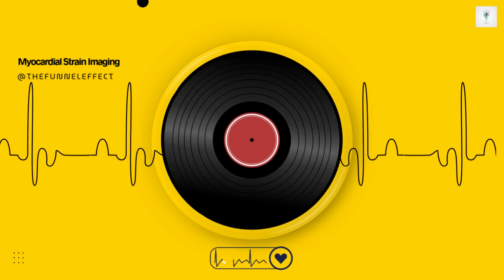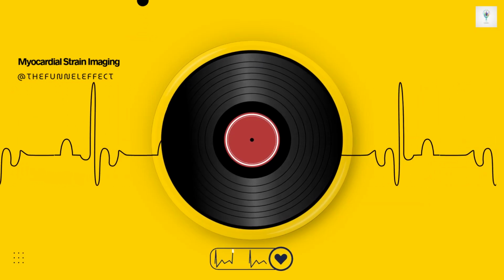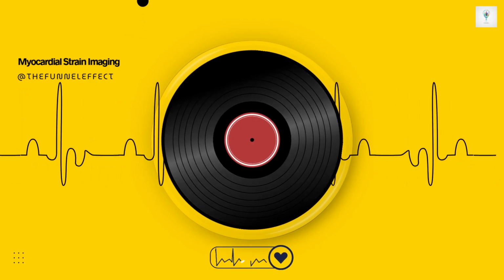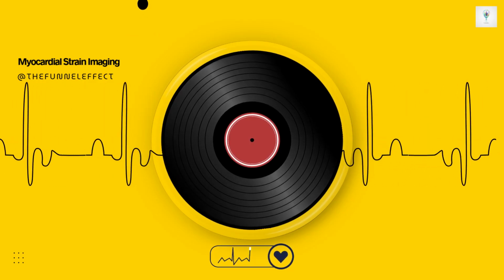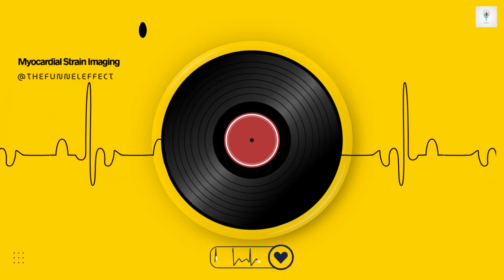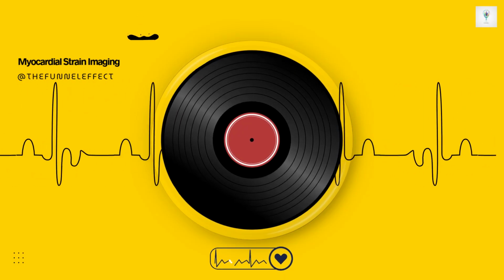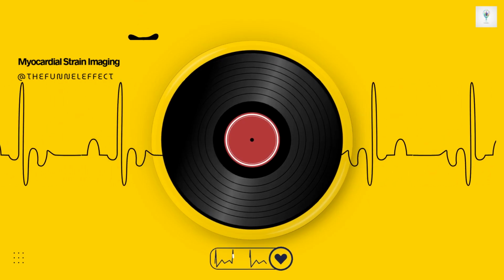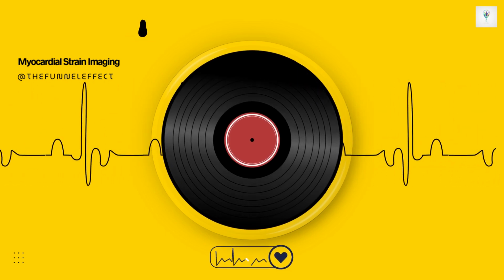And what does that mean for clinical use, if it's more variable? This is really critical. Because of that higher variability, especially when you're trying to track subtle motion differences between small regions of the heart, segmental strain measurements using CMR feature tracking are generally not recommended for routine clinical decision-making. So use FT for the big picture, the global strain. Primarily, yes. It's best restricted to global strain assessment. If you need high-fidelity regional or segmental analysis with CMR, tagging is still the reference.